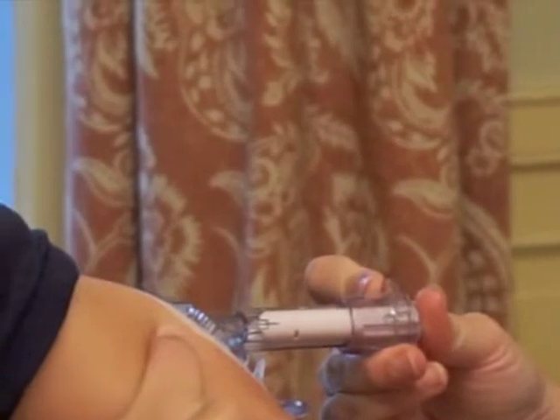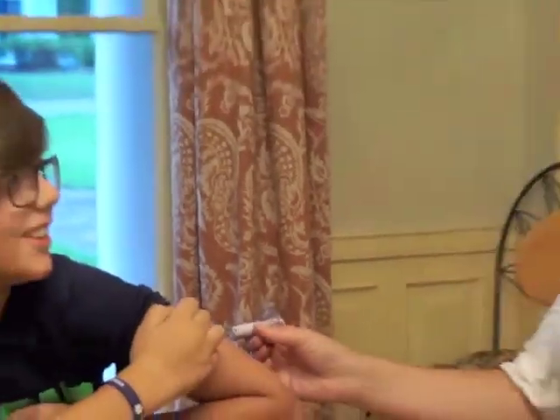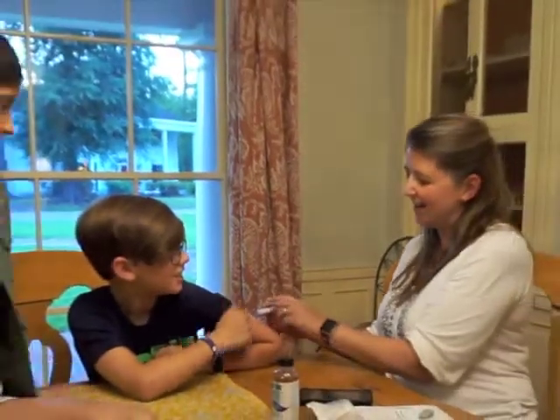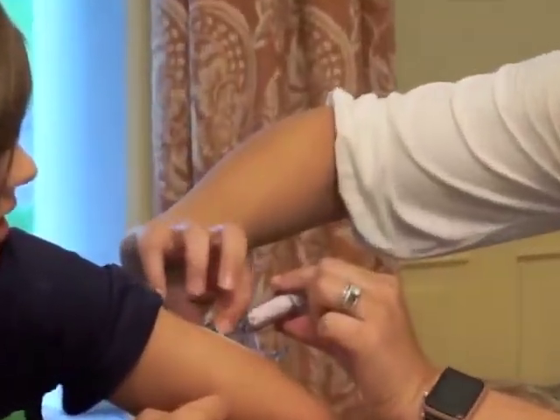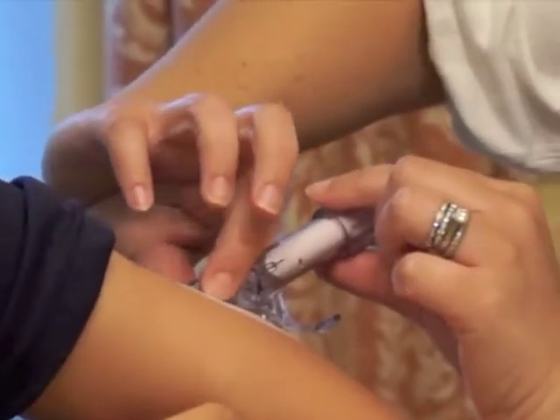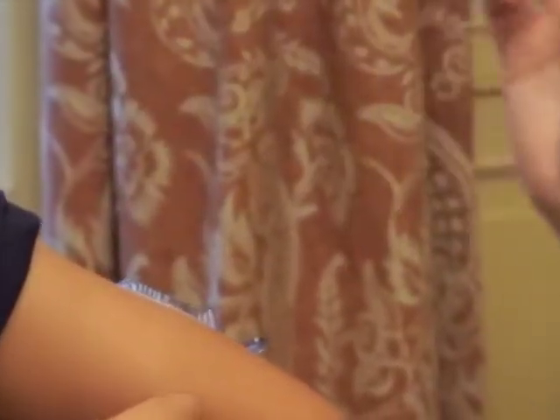Okay, on my mark — one, two, three. That time actually felt pretty good! The next step is to take the plunger out: you squeeze these little tabs and just pull the plunger out. Those tabs are very, very small and they have stripes on them.